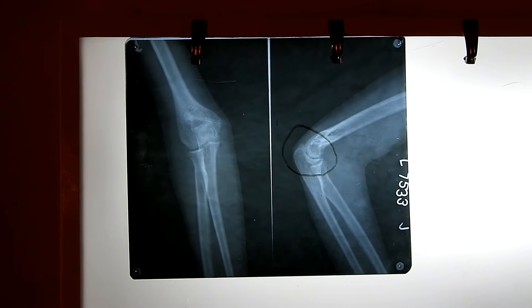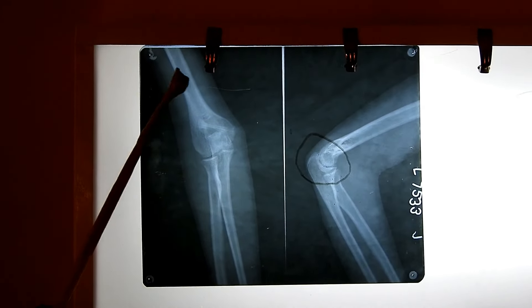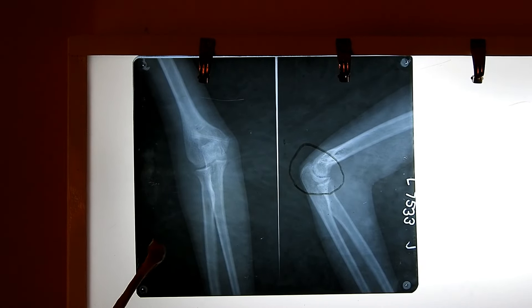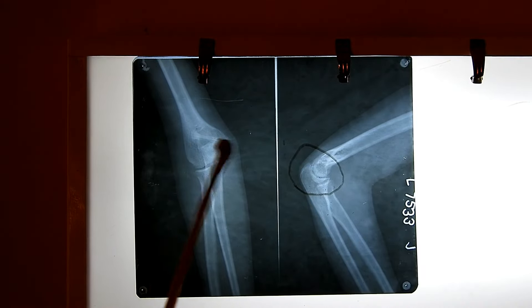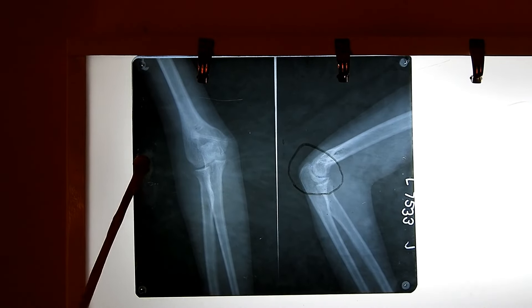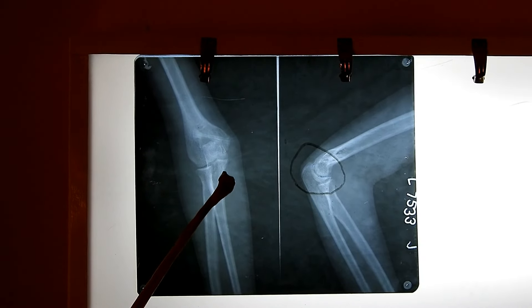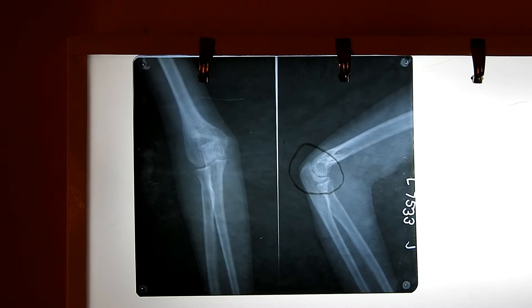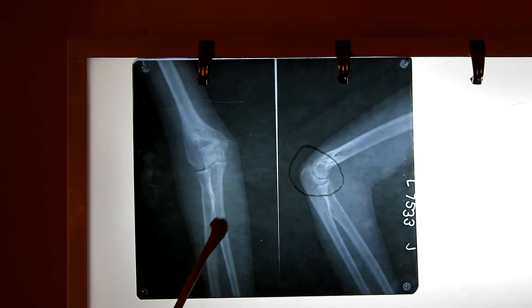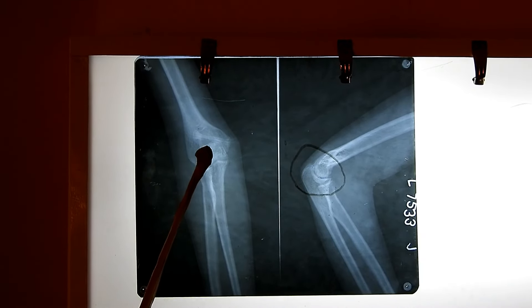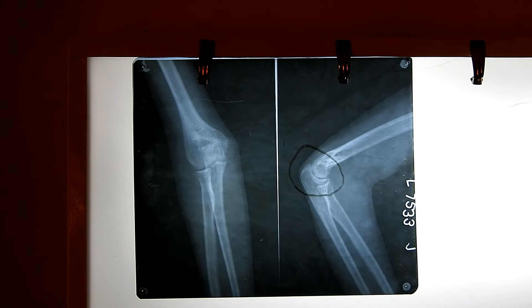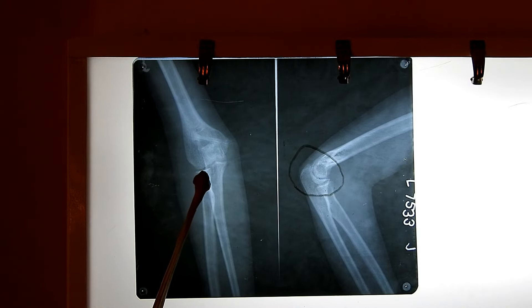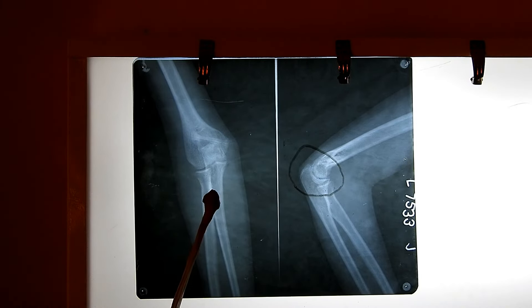The second X-ray of the upper limb is the elbow joint. This is a plain type, AP (anteroposterior) view of the elbow joint, and it is of the left side. The bones you can see are the lower end of the humerus, upper end of the ulna, and upper end of the radius. In the humerus, you can see the medial epicondyle, lateral epicondyle, the olecranon fossa, and the coronoid fossa. In the radius, you can clearly see the head of radius, neck, and radial tuberosity.